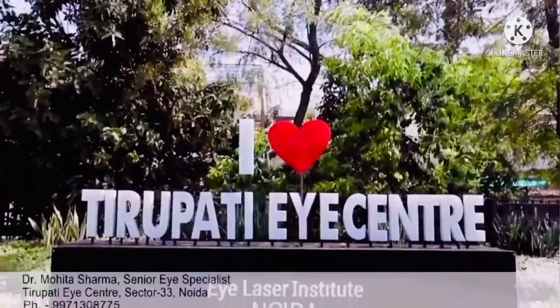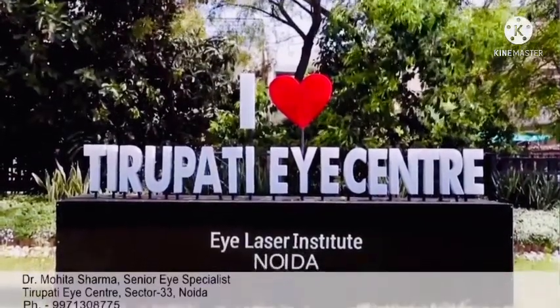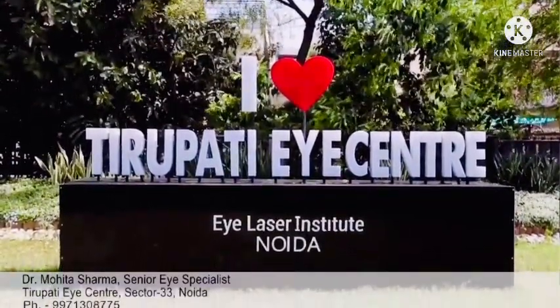Similarly, not just the phaco machine, you have to understand your phaco tip and the phaco tubings also. There may be tips which are for a 2.8 mm incision, tips for 2.2, tips for 1.8. If it's a 1.8, it may be a microflow needle with a very narrow lumen so that you can actually operate at high vacuum also.